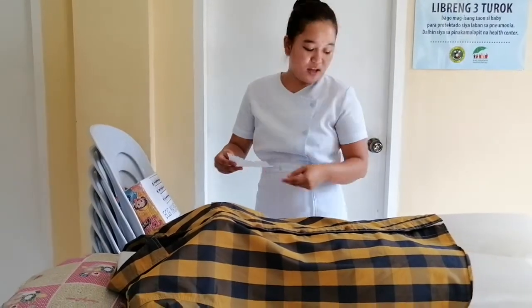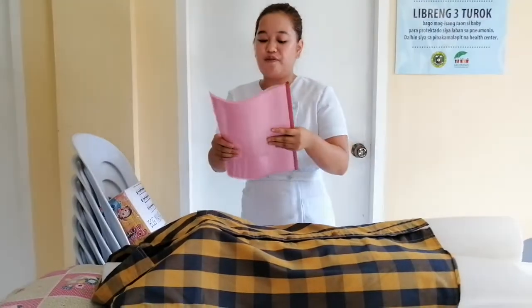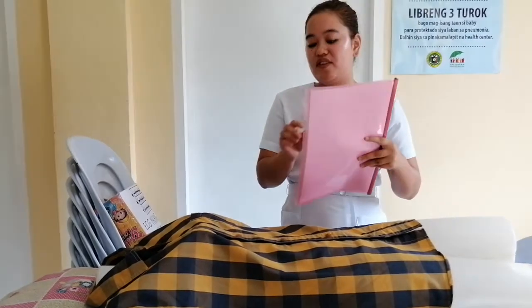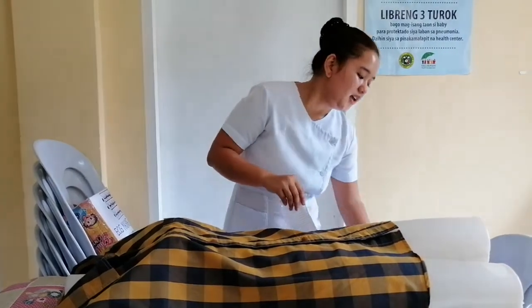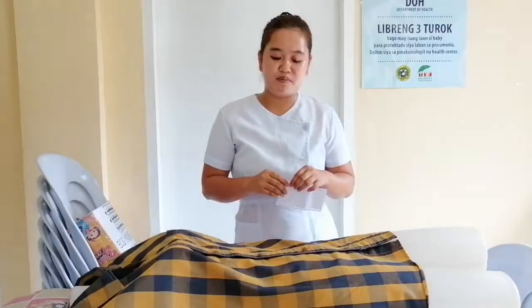And then if the result comes out, we are now going to document the following on the back part of the ECG paper. We need to document the date, the time, the name of the patient, and also the age or the sex, including also the vital signs, because those will be the basis or the information gathered to be used in diagnosing or in treatment.